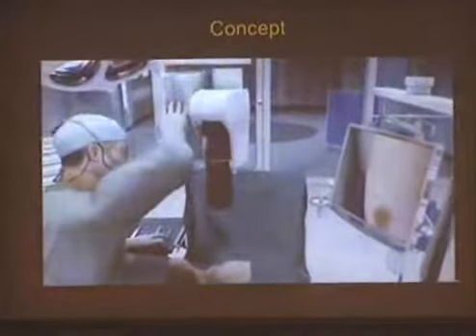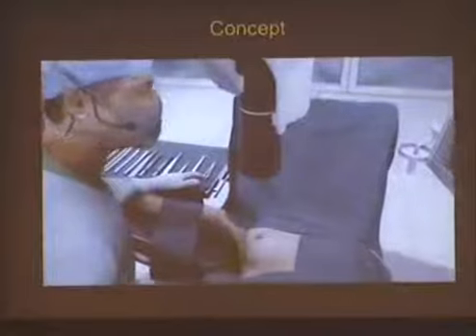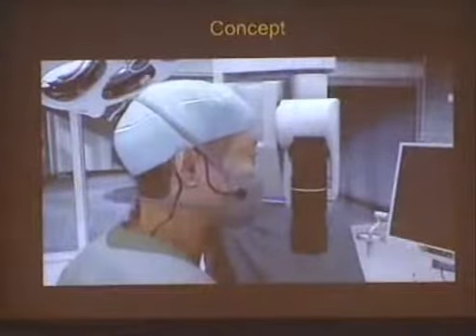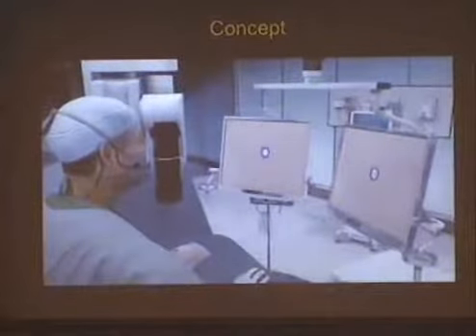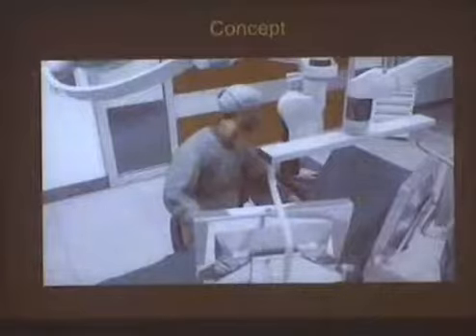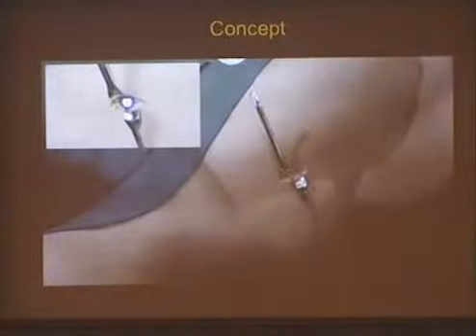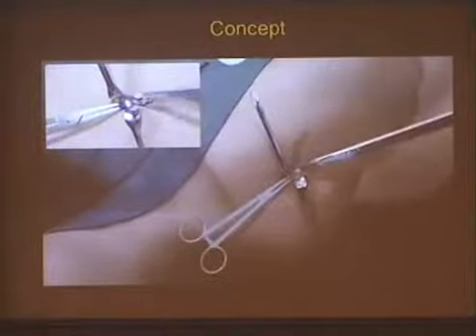So you saw here the surgeon injecting a red agent that would be maybe specific to cancer cells, and also injecting a green agent, for example, to identify the lymphatic system. And then move a camera into the field of view and go and find, in this case, for example, the sentinel lymph node with the green dye.